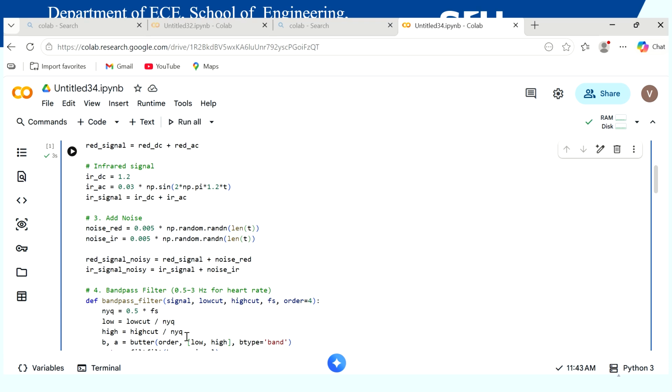The frequency components above the higher cutoff frequency will be assumed as noise, so they will not be allowed. The frequencies higher than the lower cutoff and lesser than the higher cutoff are termed the pass band. They are smoothly allowed through the band pass filter.